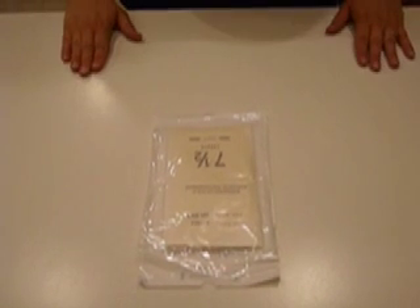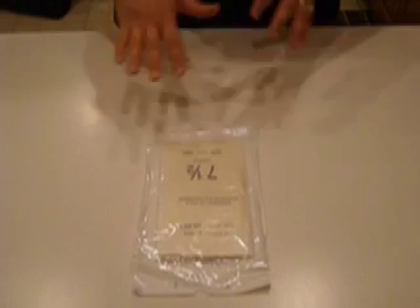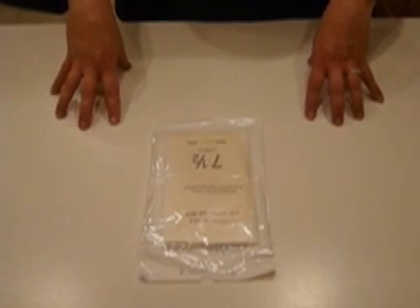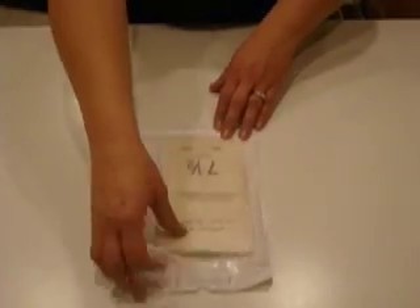Sterile Gloving. Three things we need to do first: make sure that our table height is at waist position, we've washed our hands, and the table top or surface we're using has been cleaned and dried before we set up our sterile field, which will be our sterile gloves.